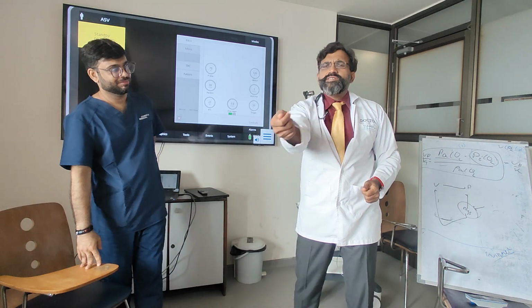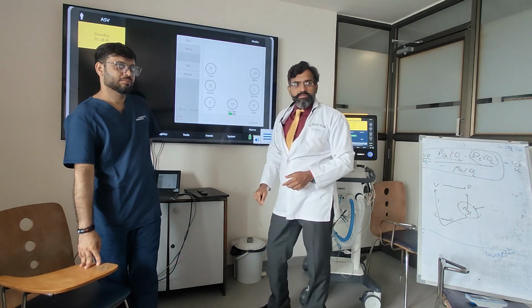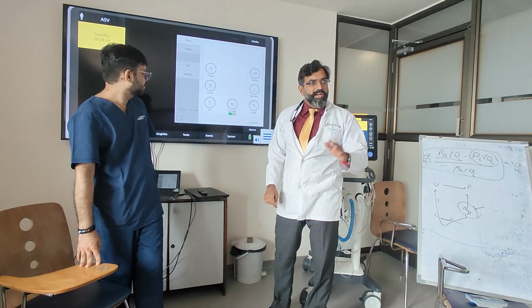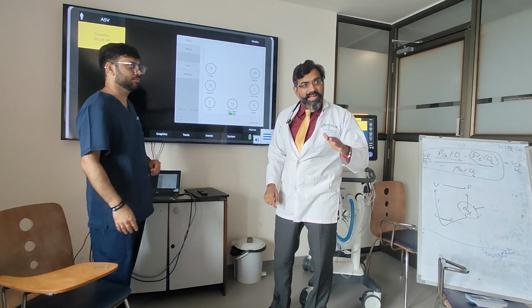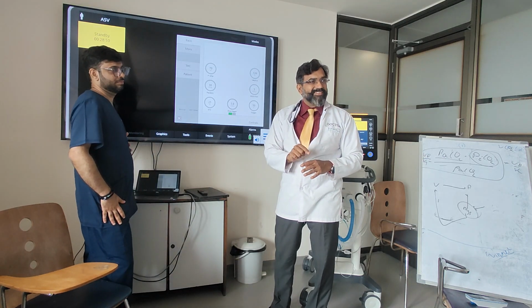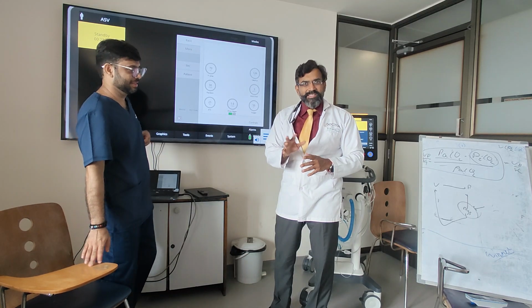Normally, you will go to the ventilator and just change the volume. But here you can't go there and change this. It is not going to do that. It will still remain at 4 ml per kilogram. This is affecting your minute volume. So the only way you can change that is by going back and changing the height. You understand the issue?